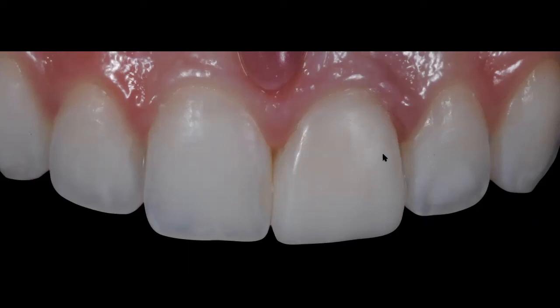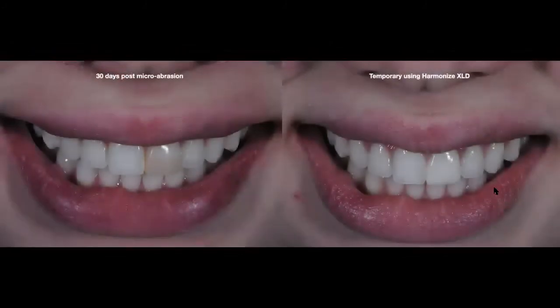And why did I do that? Because what I wanted to do when I fabricated my temporary was see if that very light composite would match the basic shade of the neighboring teeth. If the answer to that is yes, then I can go ahead and send it to my lab, because you can see, I want you to see this very high value, but this composite shade was very close to the value of the natural teeth that we had obtained after bleaching and microabrasion.